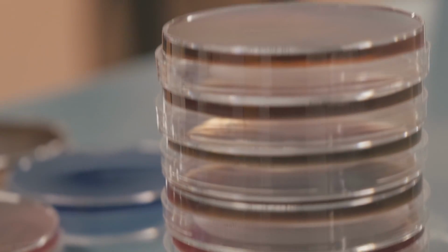Culture-based diagnostics involves a cascading series of tests, the results of which lead us to increasingly specific criteria for microbial identification. You should now be able to describe the value of selective and differential media, antibiotic susceptibility, and biochemical or immunological testing in culture-based diagnostics.